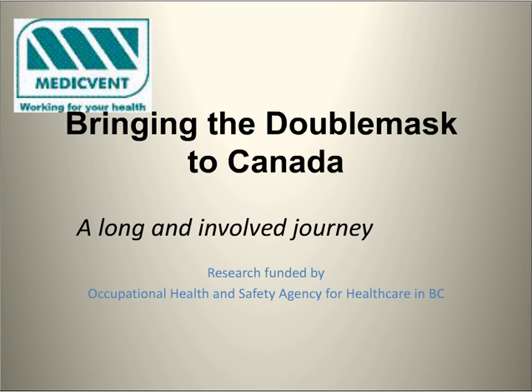So what is a double mask system? Depending on who you're talking to, you might say it's a continuous flow waste anesthetic gas scavenging system. That's how an anesthetist would probably describe it. If you're talking to a ventilation engineer, he'd say it's a closed capture local exhaust system for exhaled anesthetics. Other people might just say it's an effective means of protecting medical personnel from anesthetic gases. It's all of those, really.